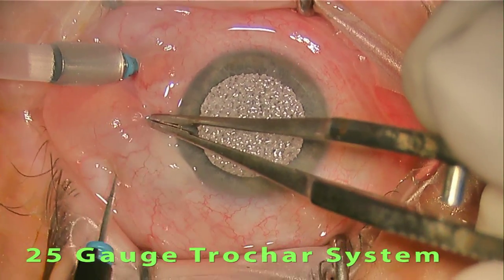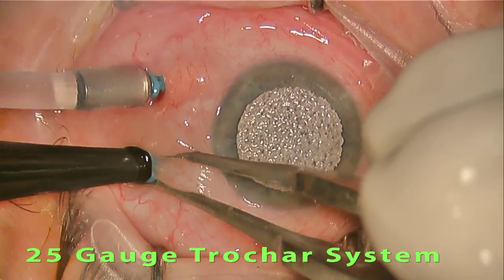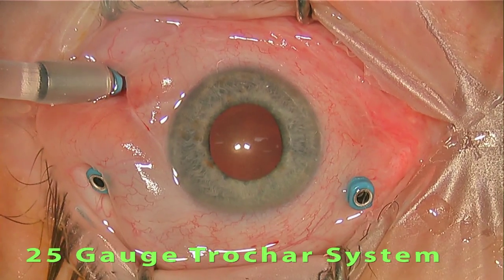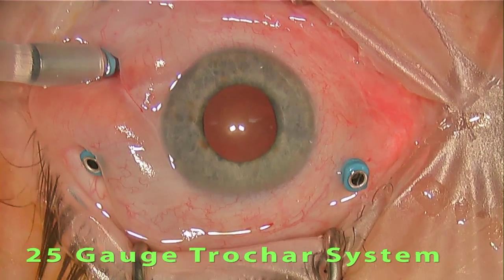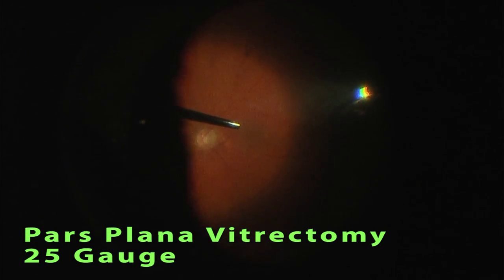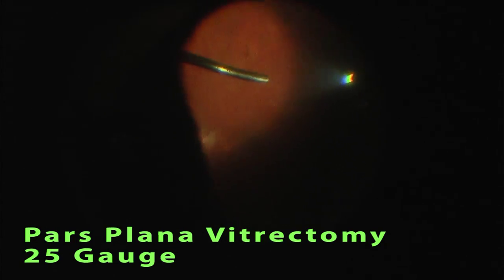The first step in a 25 gauge vitrectomy surgery is placement of these blue trocars that allow the instruments to be passed easily in and out of the eye during the procedure. This surgery is done using a microscope looking through the pupil. There you see the vitrectomy probe on the left side of the screen.